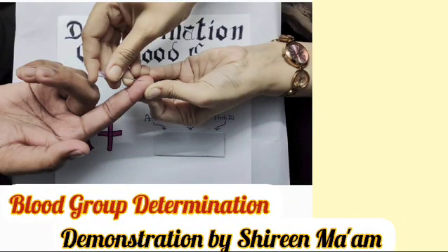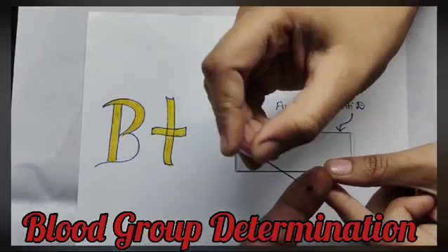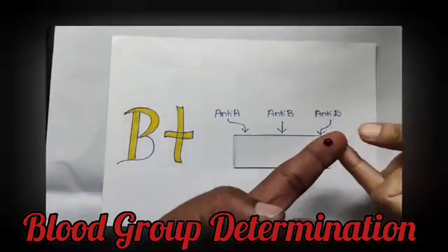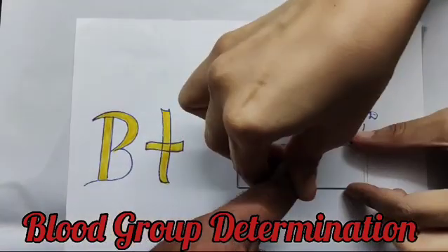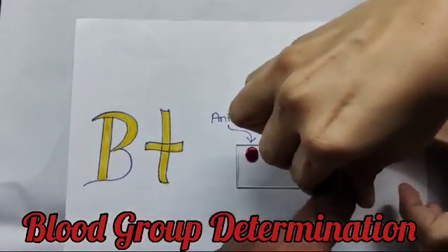Hello everyone, today I am going to demonstrate how to determine different blood groups.